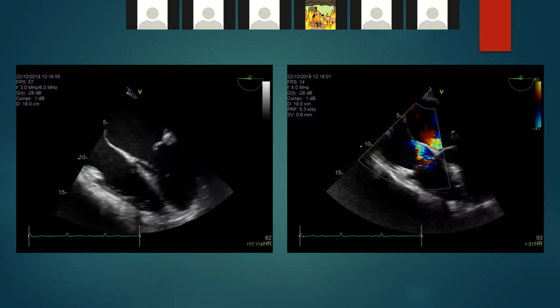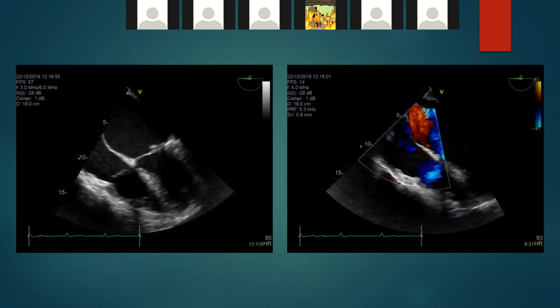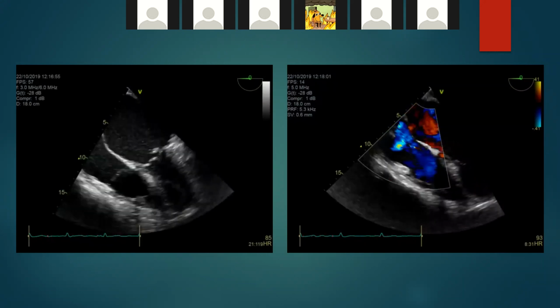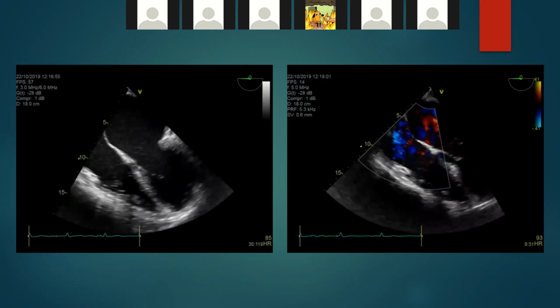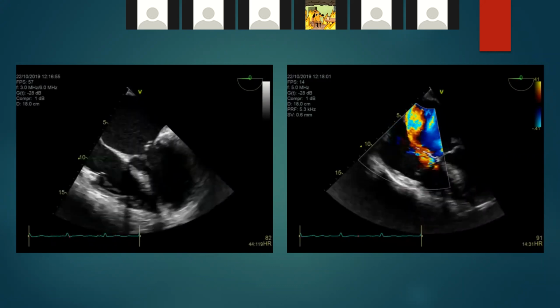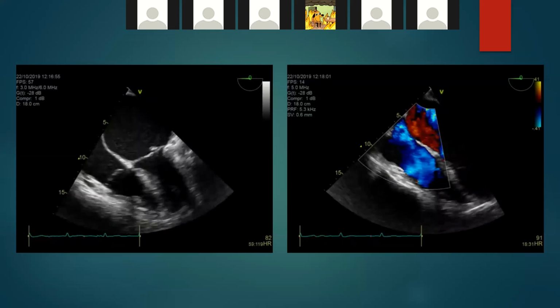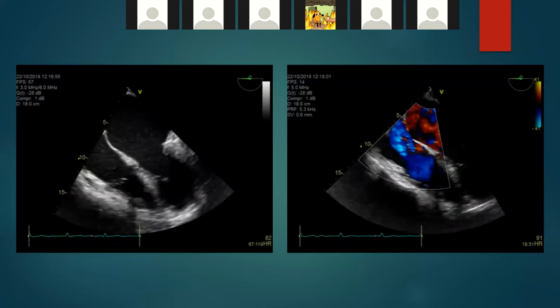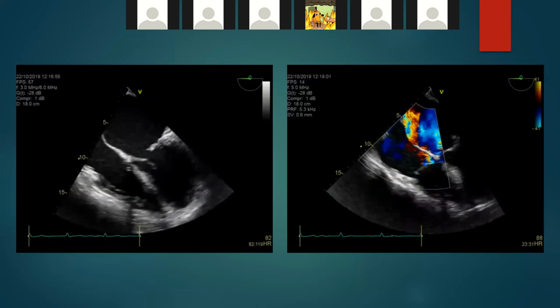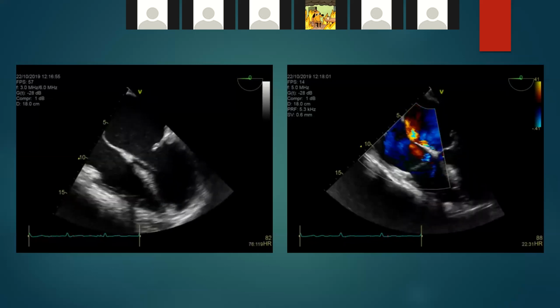Daniel, can you remind everyone what scallops we are looking at? The one to the right side of the screen is the posterior leaflet, and the one to the left side of the screen is the anterior leaflet. Is it P1, A2, P3? That transesophageal four-chamber view, remember, is equivalent to the parasternal long axis, so it's cutting through the middle. Oh, okay, so it's A2, P2.